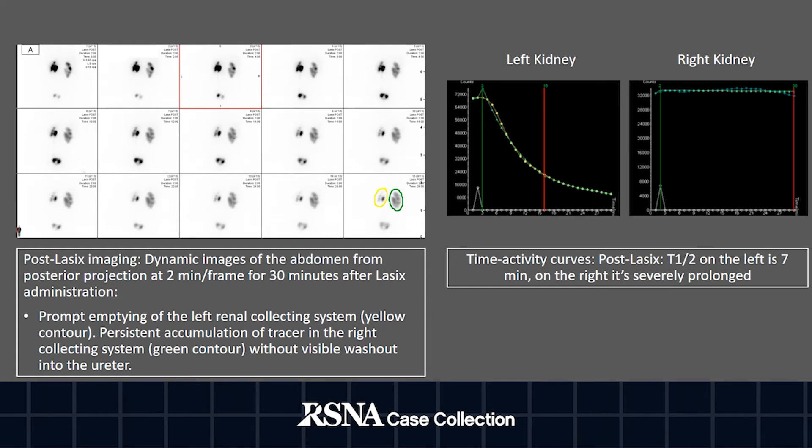On the right, however, there is persistent accumulation of tracer in the collecting system without visible washout into the ureter. This reflects in a very prolonged post-Lasix half time and is consistent with significant obstruction.